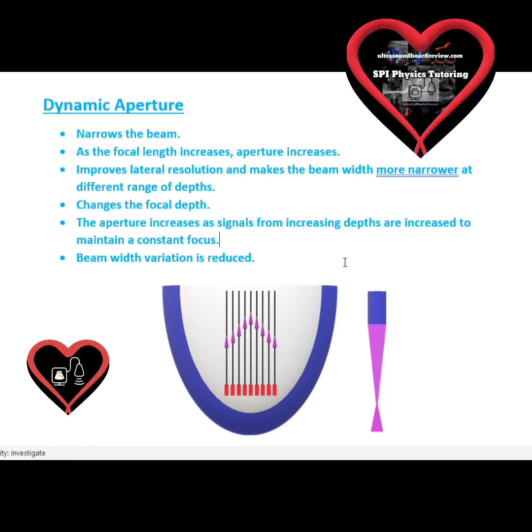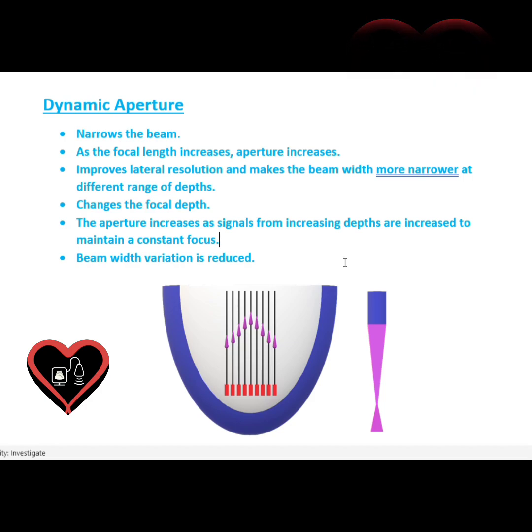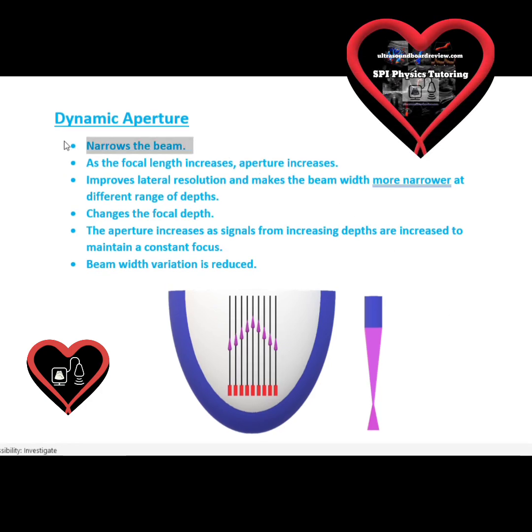The dynamic aperture function is a great way for a sonographer to narrow the beam at greater depths or various depths to improve your angular resolution, transverse resolution, and your azimuthal resolution by simply narrowing the beam, and that's key.